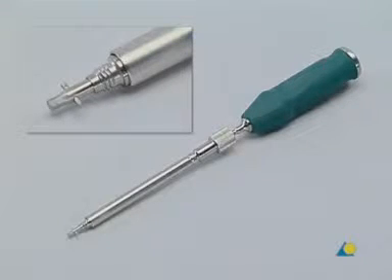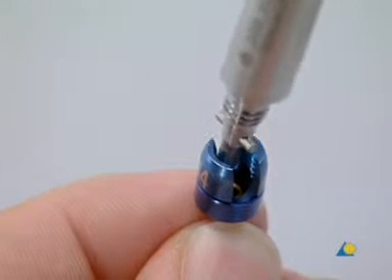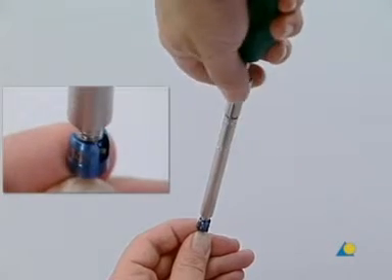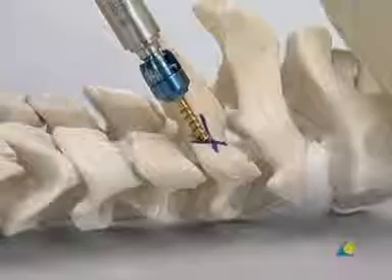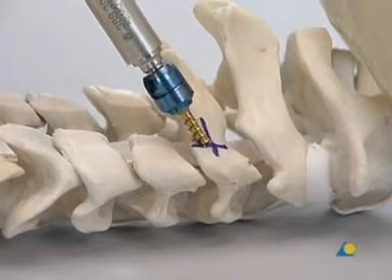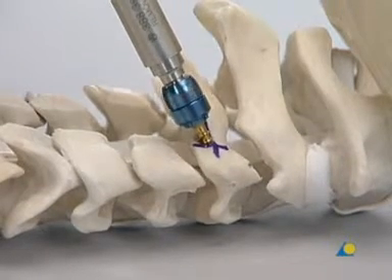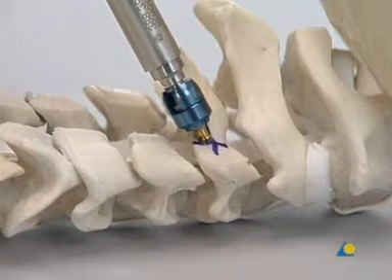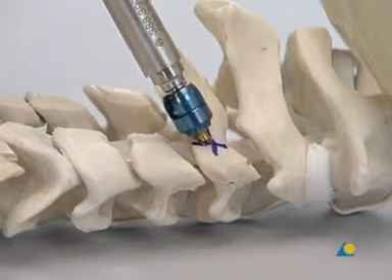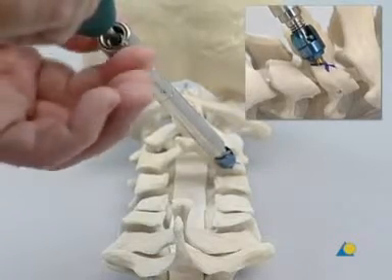The screwdriver with threaded holding sleeve and freely rotating outer sleeve is used to insert the screw. The screw is engaged by pushing down the holding sleeve and turning the knurled section clockwise until the screw is rigidly fixed. The screw is inserted into C3. As the screw is being introduced, the outer sleeve of the screwdriver is held, not the knurled section. The screw should not be inserted beyond the point where the variable axis head can still move freely. The holding sleeve is then disengaged by turning the knurled section anticlockwise.